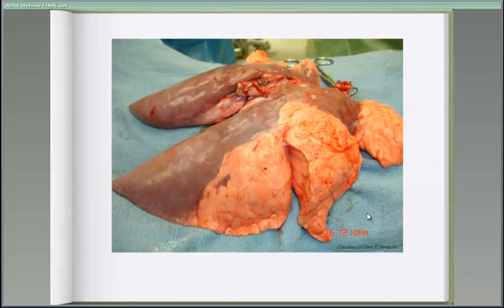Now here's a porcine lung, and this is a Tween lung model where the lung has been injured, and 6 hours later you can see with conventional ventilation there's a lot of dependent collapse. That's the discolored purplish area here. And here you see the more aerated lung, which is non-dependent. If you think about it, the healthy lung can really absorb a lot of stress and strain, and it distributes it over a huge area, and that's what buffers the potential to injure the lung. When the lung gets smaller, of course, the area that you can potentially injure becomes more magnified, and so the lung will load in a different region. And this may be important in terms of stress distribution. And of course, this is what fuels low tidal volume strategies and so on. But it may be a little bit more complex, and there may be more interplay between the distribution of ventilation than just simply tidal volume. And this may be one of the reasons why recruitment may be beneficial.